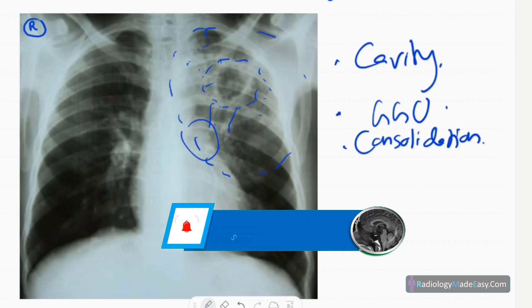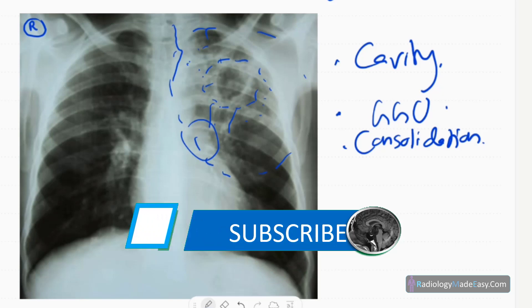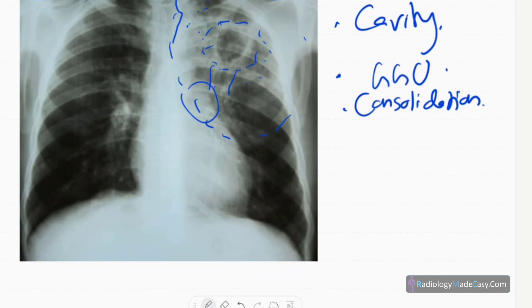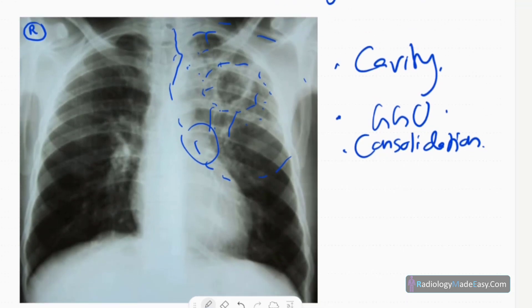The right lung field is expanded, which can be compensatory. A slight deviation of the trachea is seen to the left side, denoting slight volume loss in the left upper zone region. No cardiomegaly, no pleural effusions, no pneumothorax, and the right paratracheal stripe is normal.